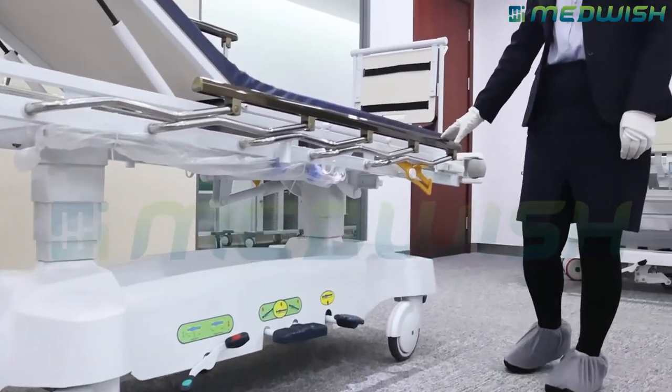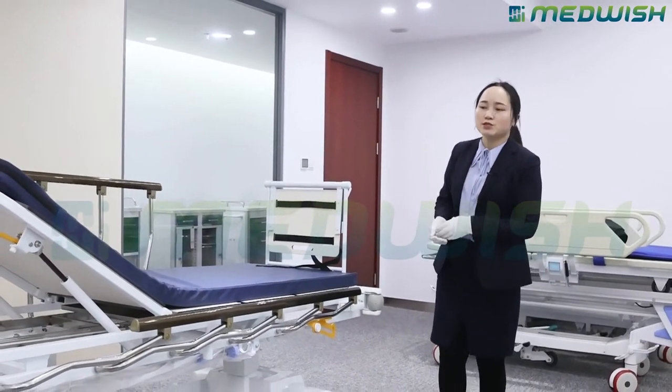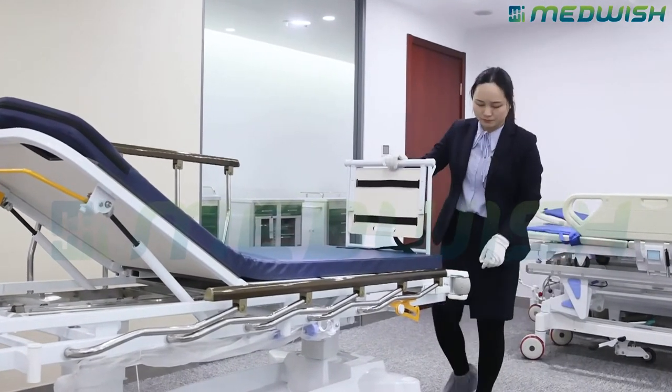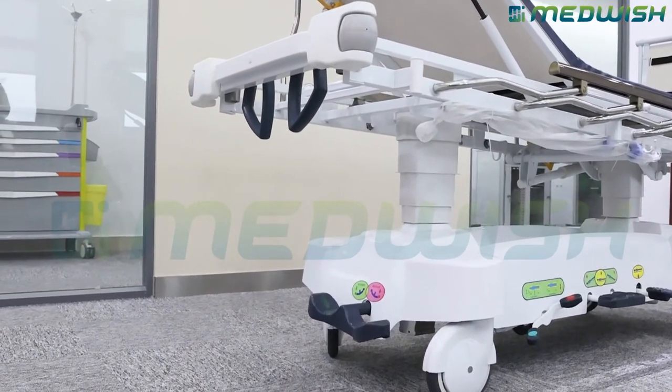To guarantee the safety of the stretcher, we have equipped it with a central brake. You can control it at the head position or the foot position. The red one is to lock it.